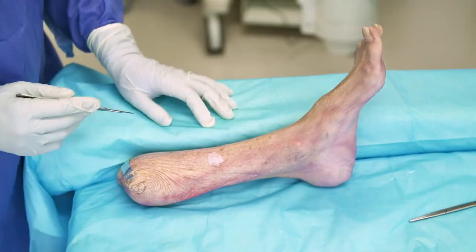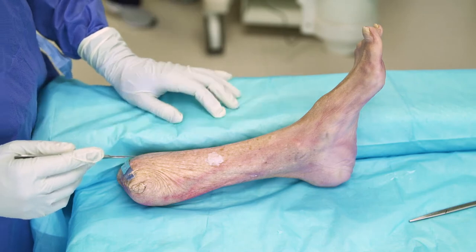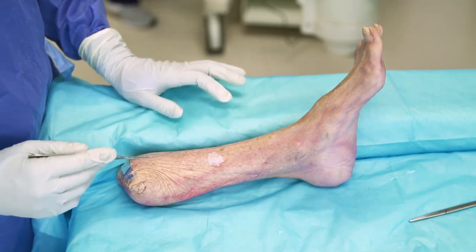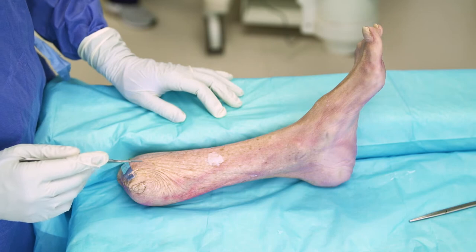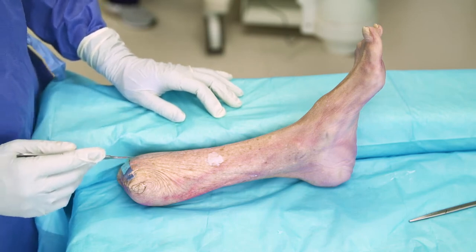These can be used for both fracture fixation and for fusions like a lapidus, and we'll demonstrate that here. This can be used for fractures of the first metatarsal or Lisfranc dislocations of the first TMT joint. It can also be used for lapidus fusions or arthrodesis of that joint as well. We'll demonstrate all of its uses here.